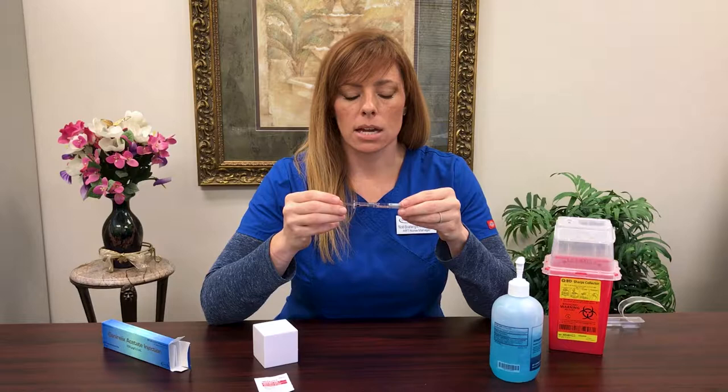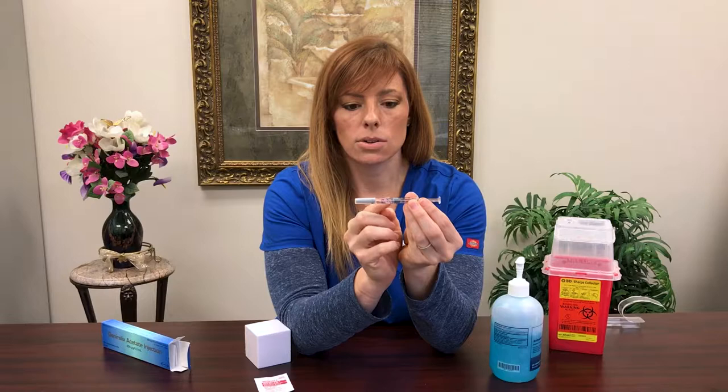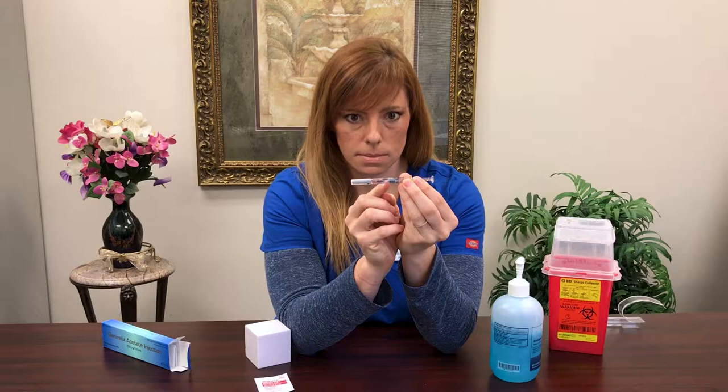For the Ganorelix injection, it comes in your pre-filled syringe. There's a gray stopper on the end, and you'll see in your medication there's also a very large air bubble. I do not want you to get rid of the air bubble — that's one of the only times you'll hear me say that, but leave the air bubble in.